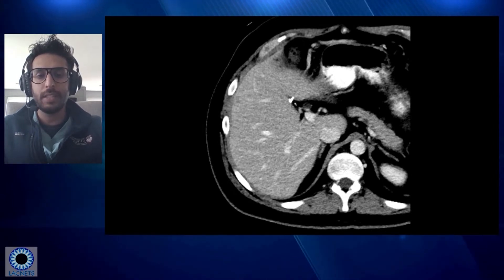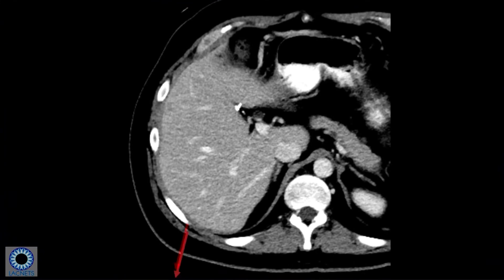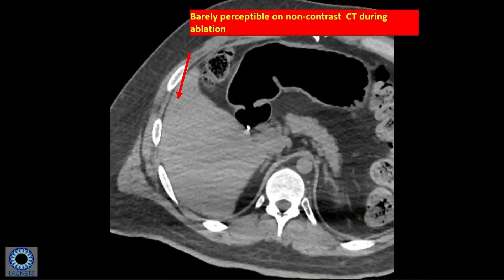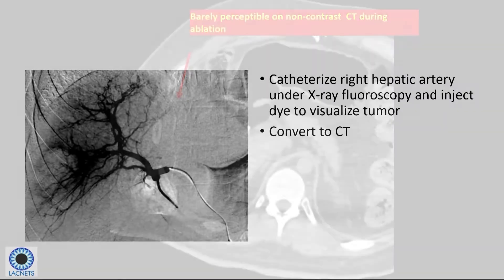Here's a CT scan of the liver — a single slice image. You can see there's a tiny, tiny speck there of a tumor. As you can imagine, it's barely perceptible on this diagnostic CT scan taken with contrast. When we bring the patient for ablation, we can't give that dye, so it's almost impossible to see this lesion and understand where to position the needle. As I mentioned, barely perceptible on the non-contrast CT.